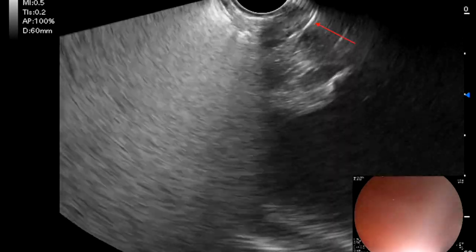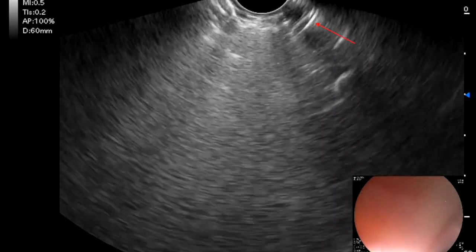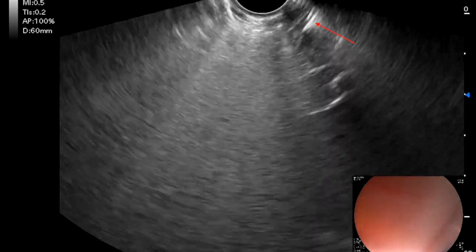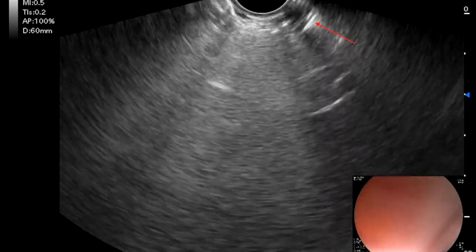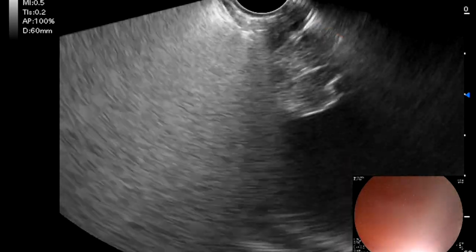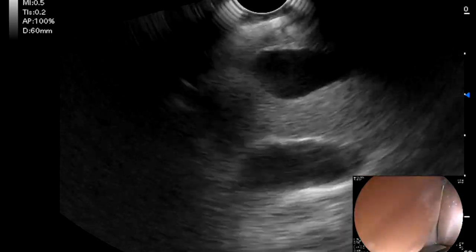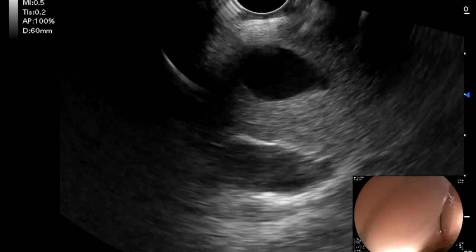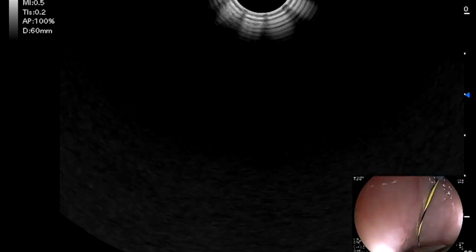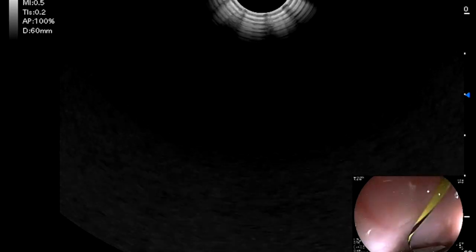We carefully advanced an FNA needle into the pericardial space, seen here with the arrow, confirming positioning by injecting contrast under fluoroscopic guidance. We then advanced the wire into the pericardial space and passed the JAG wire ERCP catheter over the wire in order to obtain EUS-guided epicardial access.